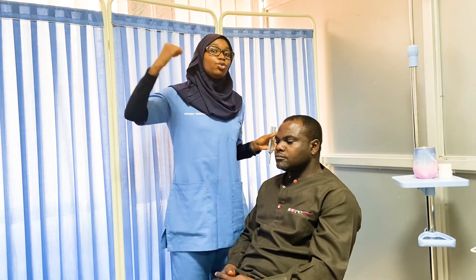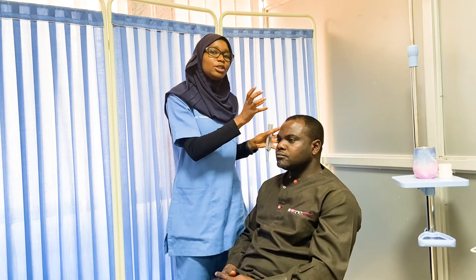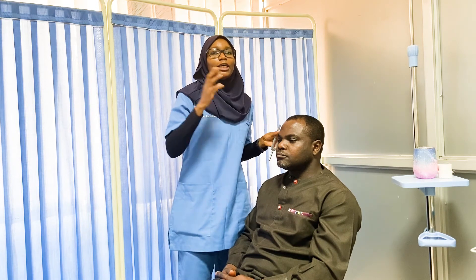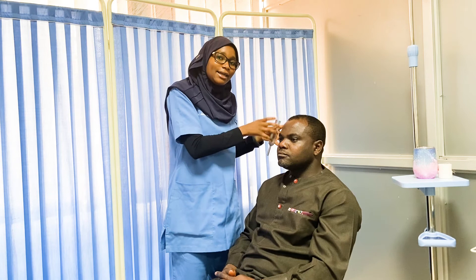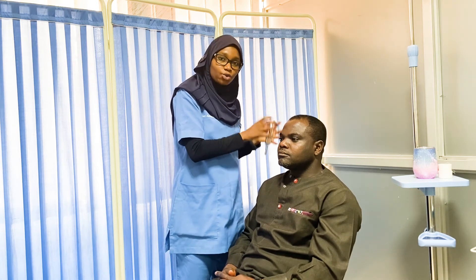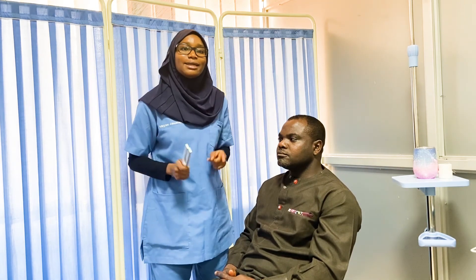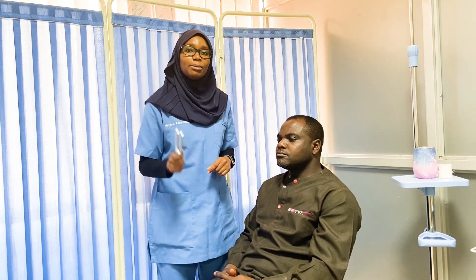To summarize: if you do a Weber test and the patient hears it loudest in one ear, and the Rinne test was abnormal for bone conduction in that ear, then that ear has conductive hearing loss. But if the Rinne is normal on both ears and the Weber lateralizes to one ear, then the ear it lateralizes to is normal, and the other ear has sensorineural hearing loss. The Rinne test alone can only tell you if hearing is normal or if there is conductive hearing loss — you need the Weber result to identify sensorineural hearing loss.